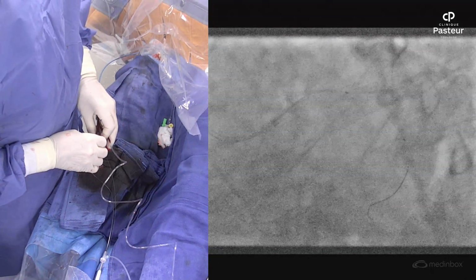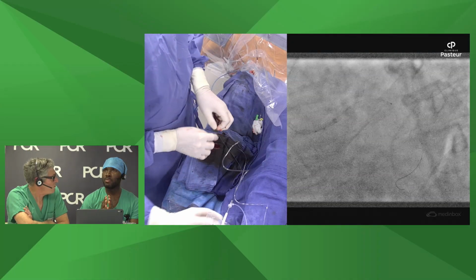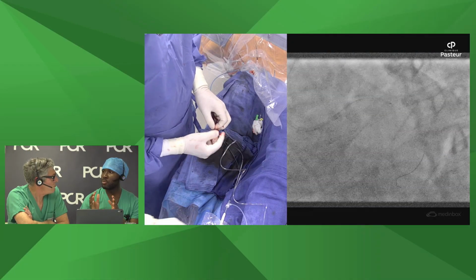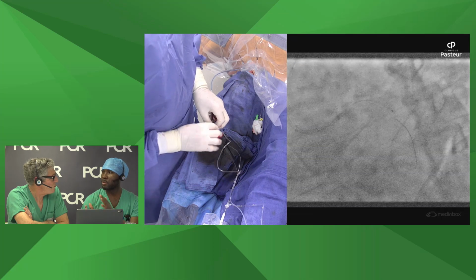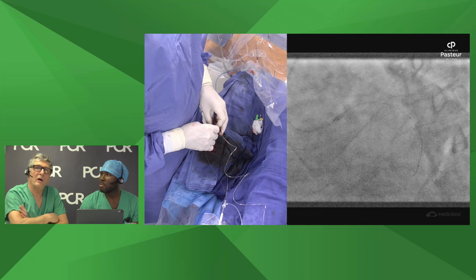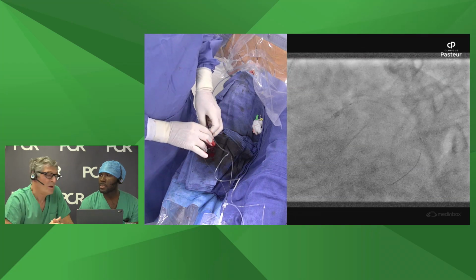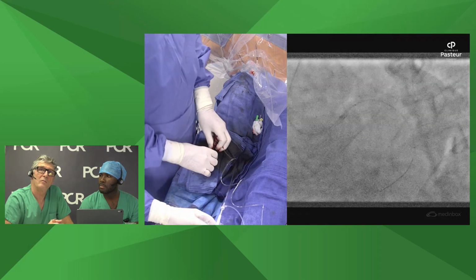Generally, in your practice for the left main, what do you prefer for imaging, IVUS or OCT? What is the best? Today we are using mainly OCT, or OFDI.